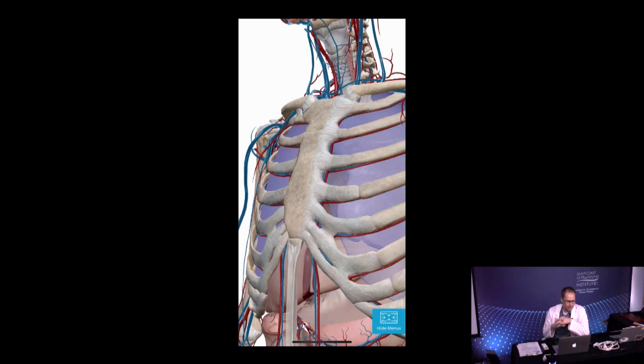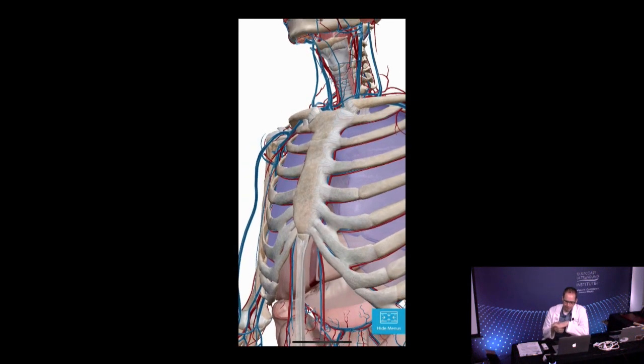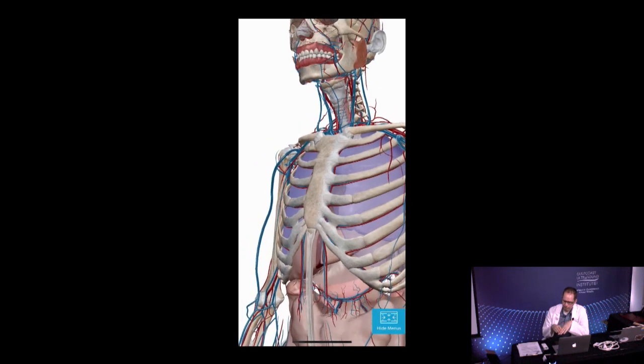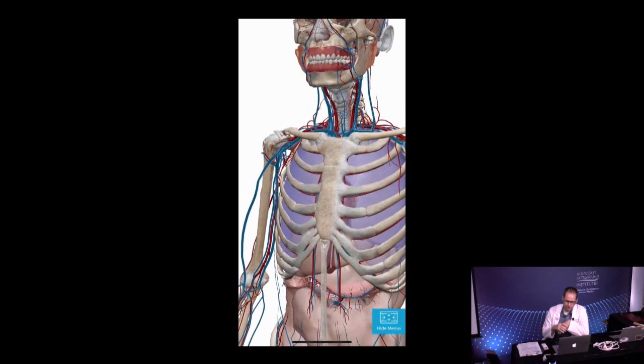So there's lung there. You have the internal mammary artery and vein that are lying right next to the sternum, so those are potential complications for hitting those there. The other option is doing a subxiphoid approach. You're going to have the liver, but if you're going in a very superficial plane, you shouldn't have much that you're going through and may not even injure the liver.